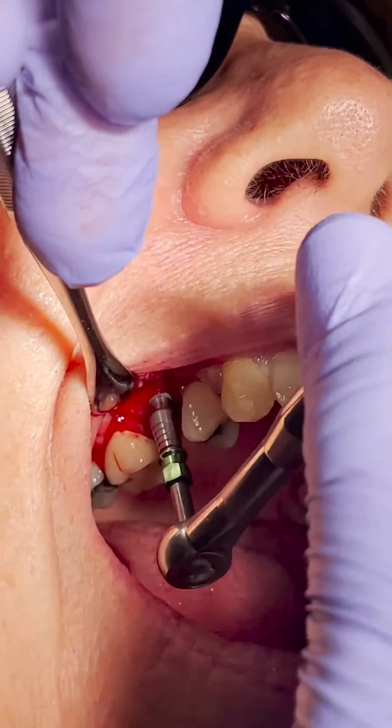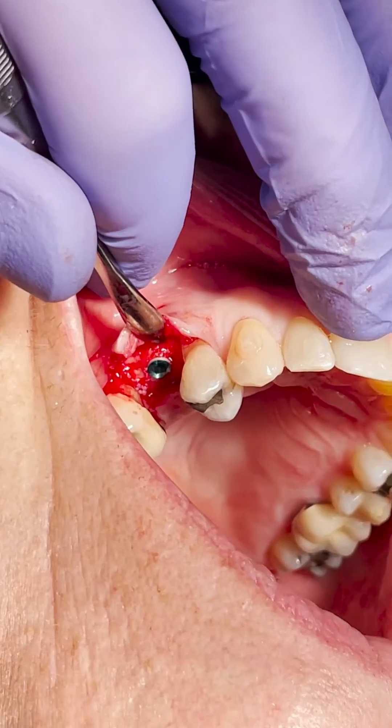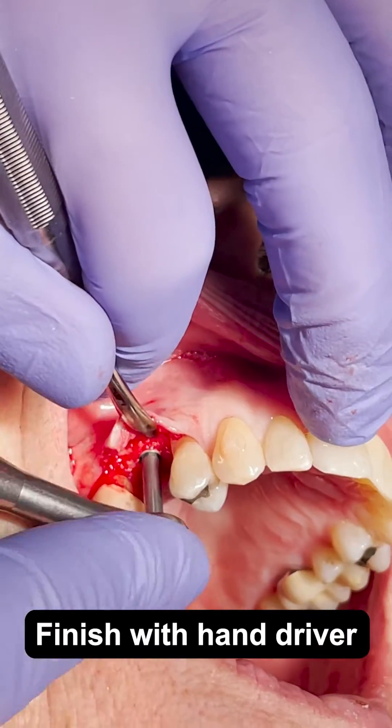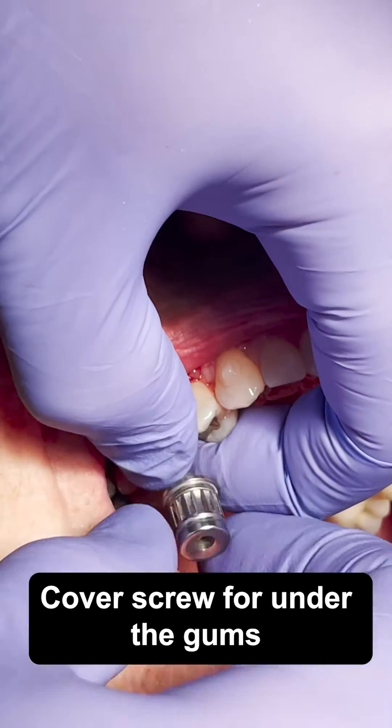Once it's about three-quarters of the way in, I pop that little transfer off and take it the rest of the way with my hand driver. I'm using a little cover screw on this one — going to cover this one up under the gums.